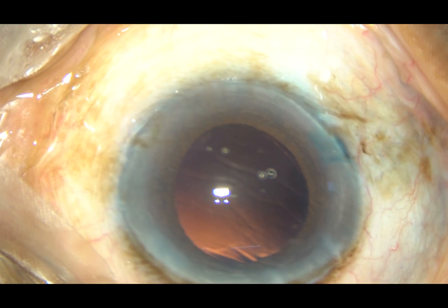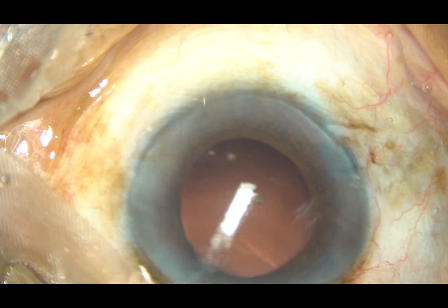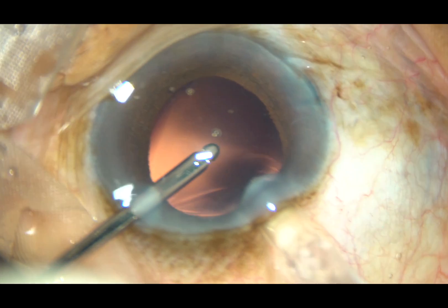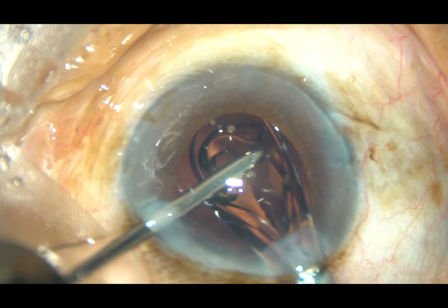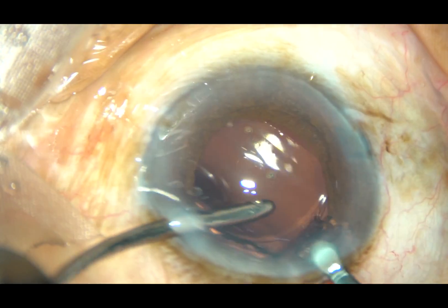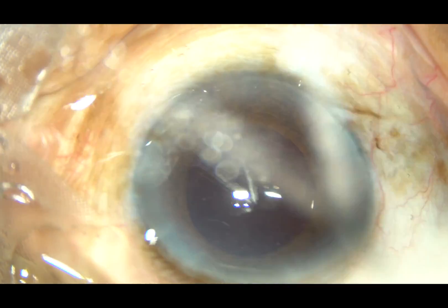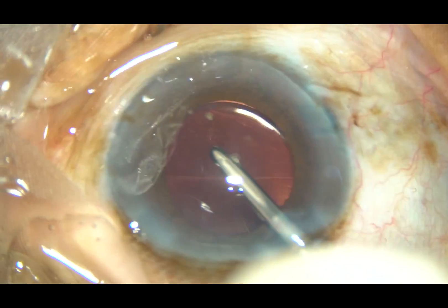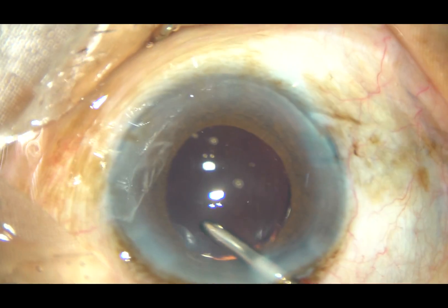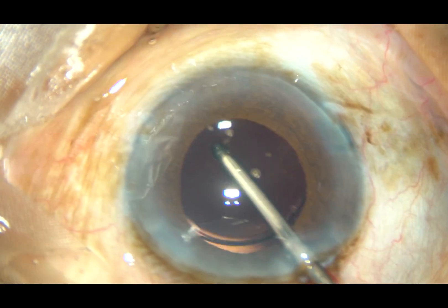And now, the rest of this surgery is being edited to shorten the time. Cortical cleanup has been done. Now, this is hydroimplantation of a hydrophilic monofocal single-piece intraocular lens. Just by a tap of the left-hand instrument, the lens goes into the capsular bag. And now, whatever viscoelastic was in the lumen of the cartridge is irrigated out by the irrigating probe itself.